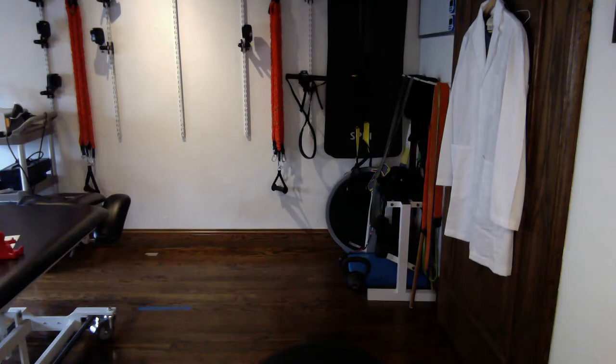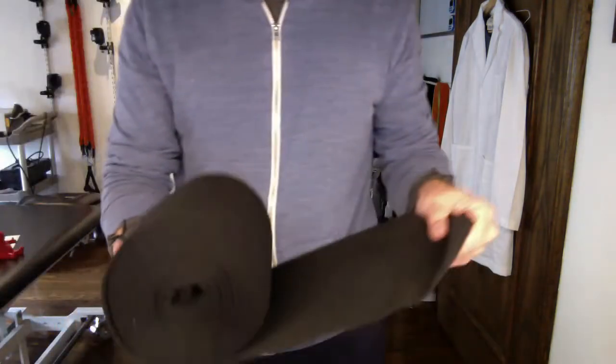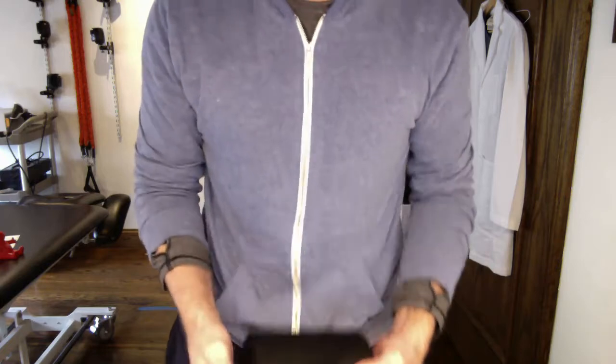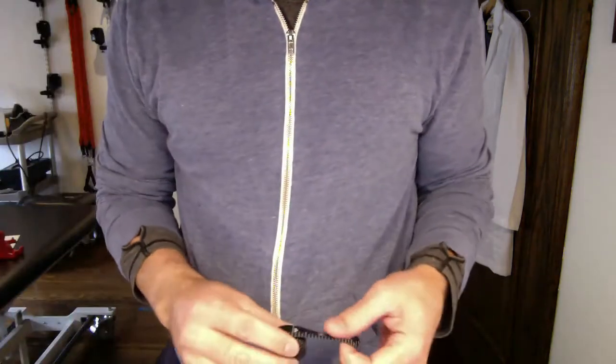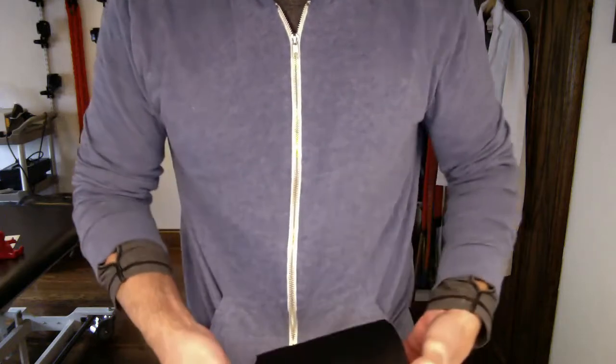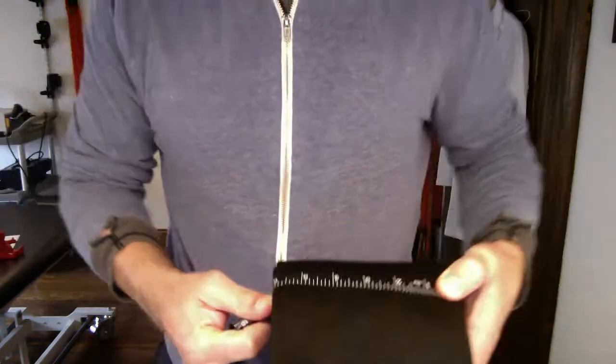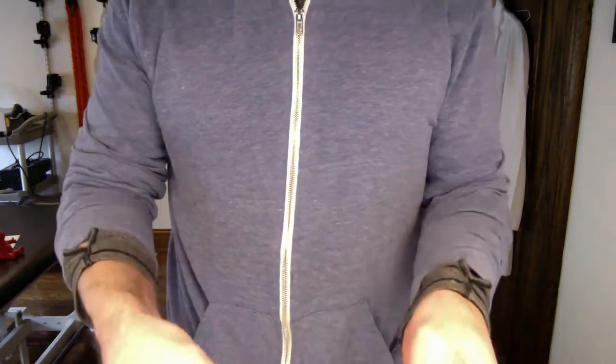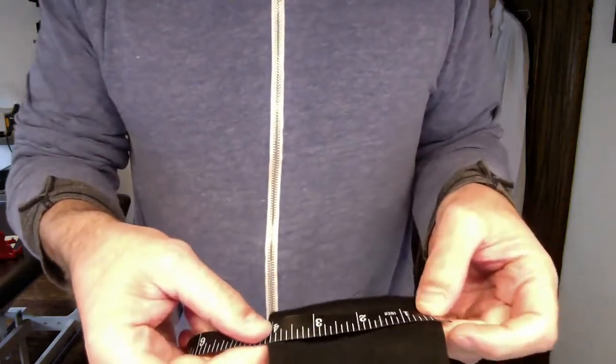That something underneath can be a two-ply tensor bandage. I just cut these in about six-inch width — six-inch length for the upper extremity and eight-inch length for the lower extremity. So this is the length for the lower extremity. Six-inch for the lower extremity is what I use, and then for the upper extremity I use four-inch.